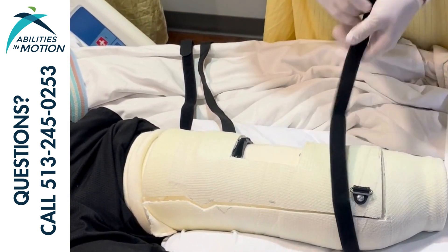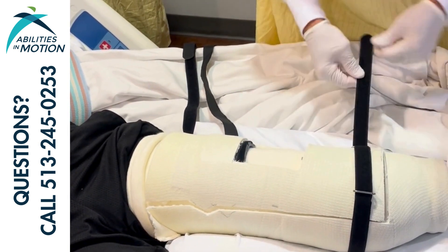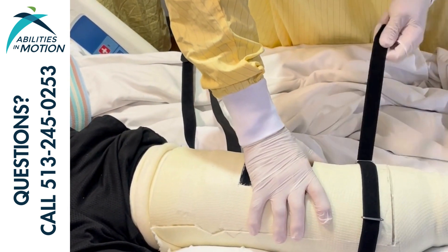If you put the cast on and notice the kneecap is sitting against one side of the window or the other, kind of against the edge, you want to reposition it to make sure that you're not going to get any rubbing at the kneecap.